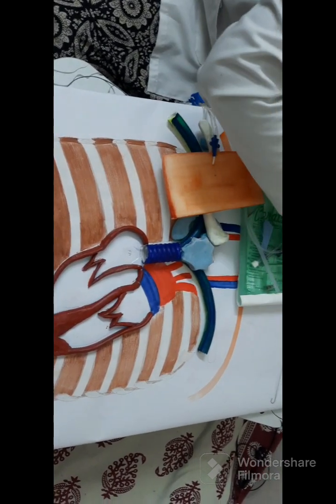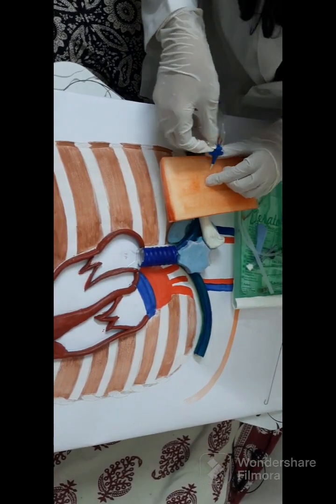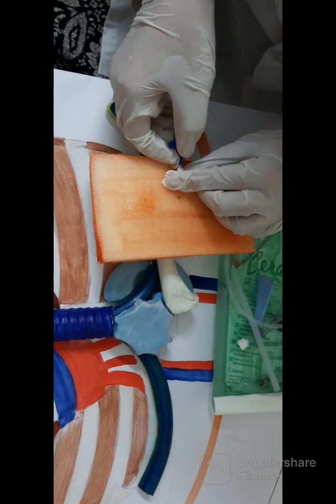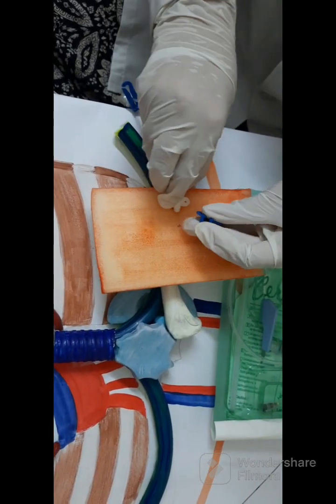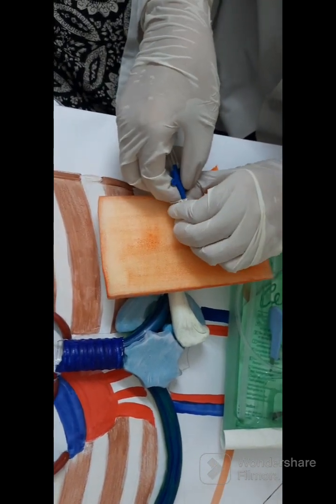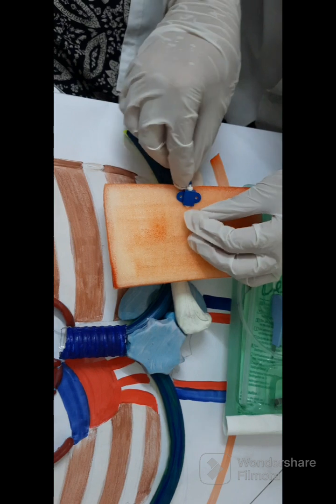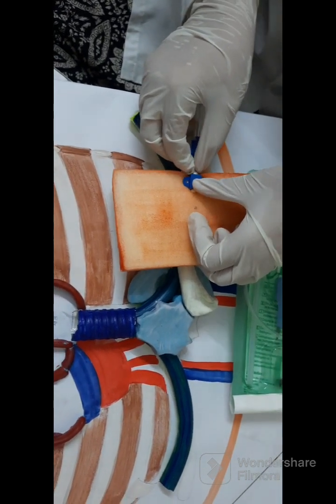So we'll ensure its position, and then we'll suture it so that we can easily see the point where the insertion has been made. Then we will suture these points so that it remains in its place, and we can also see the insertion site correctly.